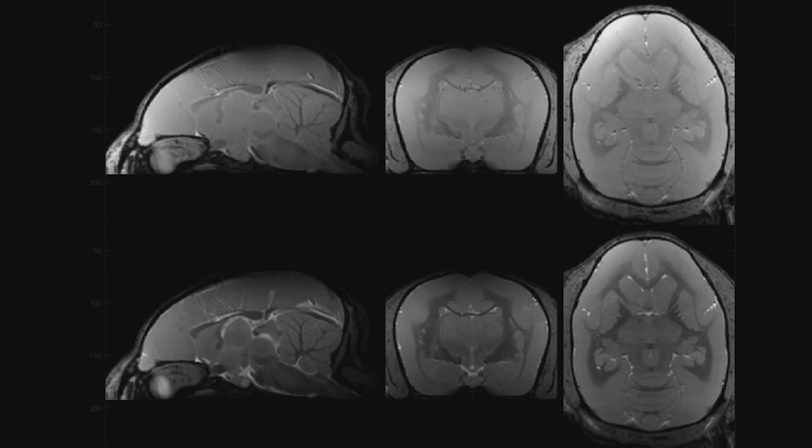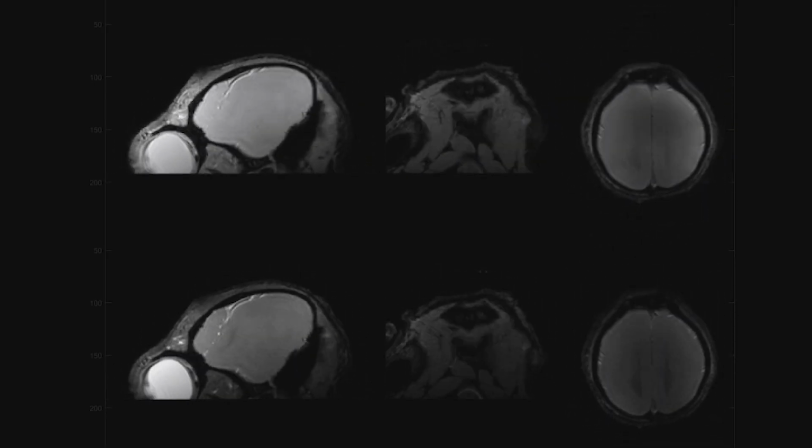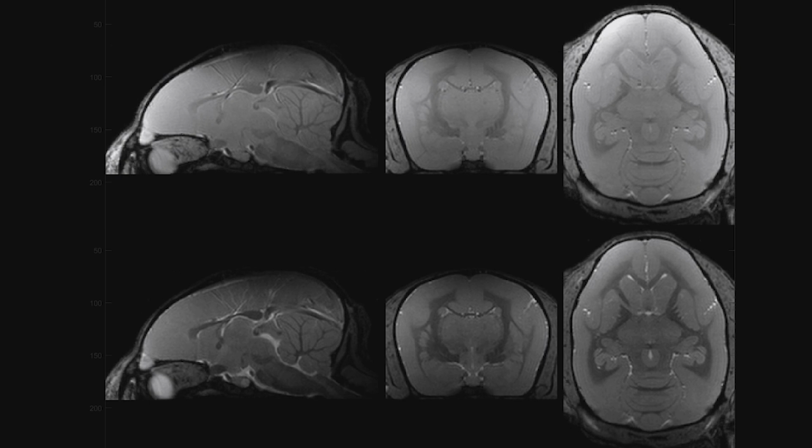So if we look at that, here's the proton density and MT image for a marmoset acquired in 3D, shown together at the same time. This image, admittedly at 9.4 rather than 4.7 Tesla now, is acquired in about 7 minutes. So it's much faster, it's 3D, it's high resolution, and we don't get the rubbish signal that you'd get if you used an inversion preparation in MP-RAGE. So this is one method we can use to get high-quality 3D structural images from animals.